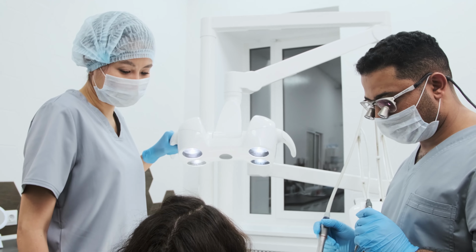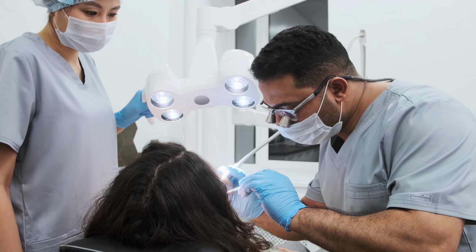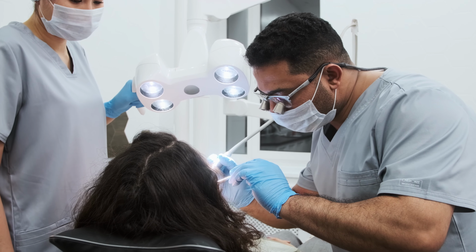So stay tuned. First, when we as dentists see the dental cavity and remove it with various drills, before that we usually use some dental anesthesia to numb the area so you don't feel any pain during the procedure. After that, we carefully examine the lesion and remove everything that is not healthy.